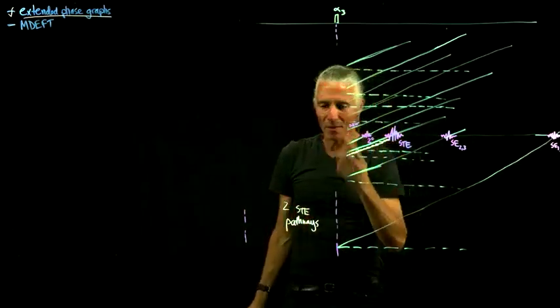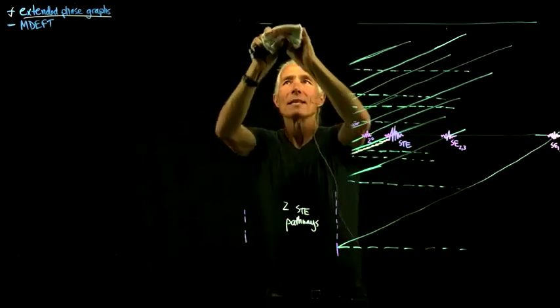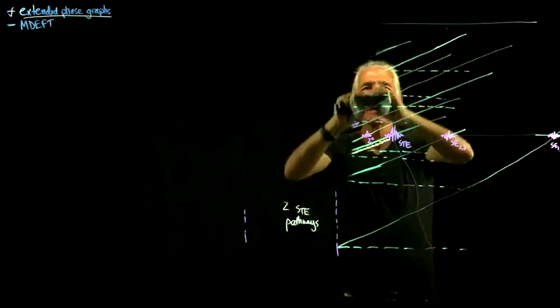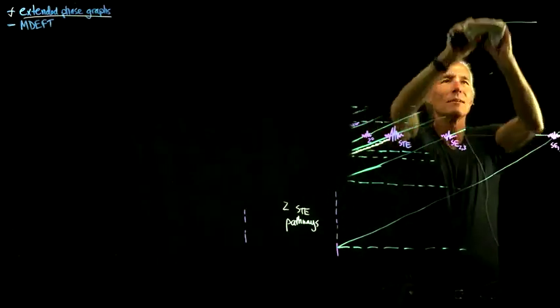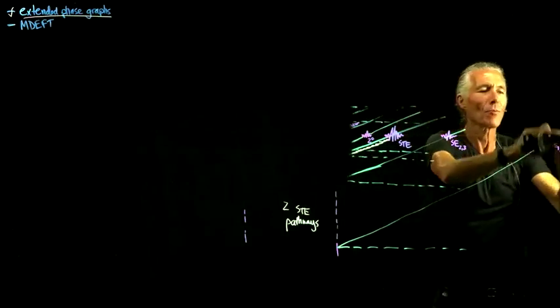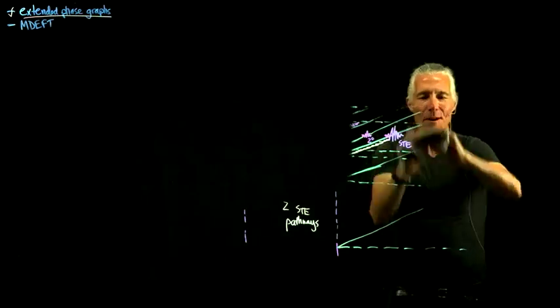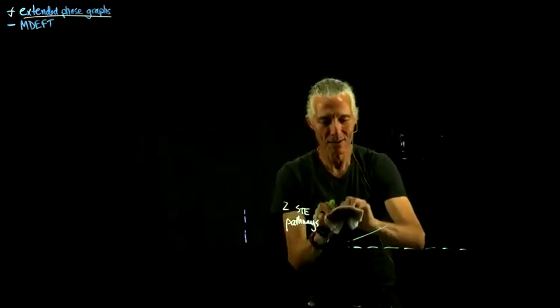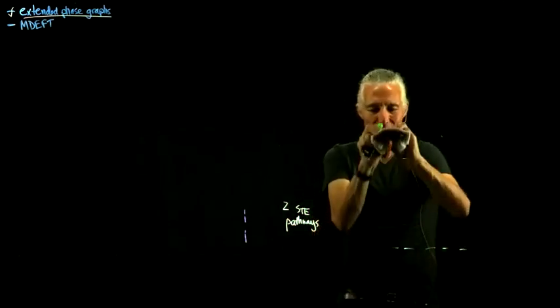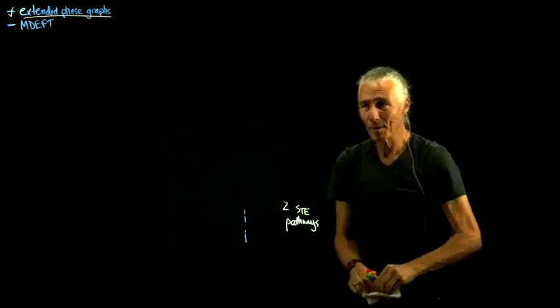One other thing these graphs are used for: a lot of times when you're doing all these pulses, you end up with some excess magnetization that you don't want. And so you do another RF pulse called a crusher, which is intended to damage the magnetization. But of course, whenever you do another RF pulse, you're going to generate these four pathways again.